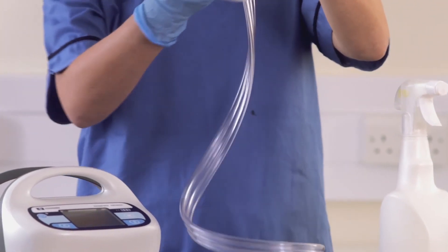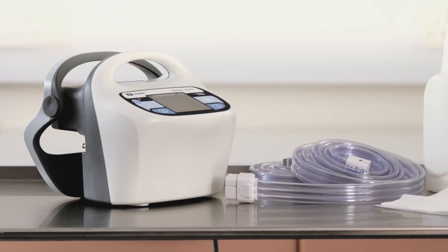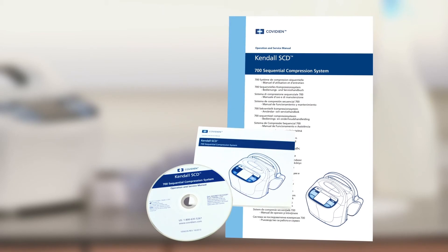The tube sets can be cleaned with a soft cloth dampened with water or mild detergent. A full list of approved cleaning agents for the controller and tubing sets are available in the IFU manual.